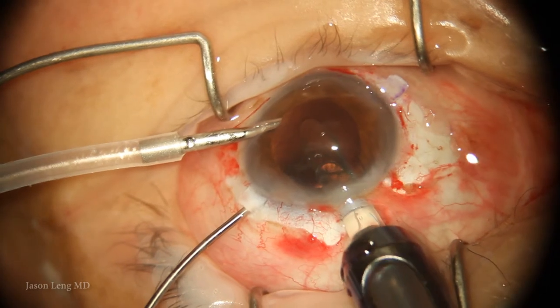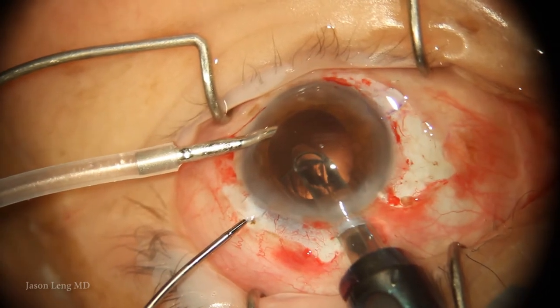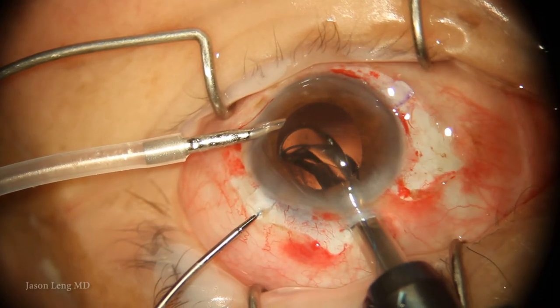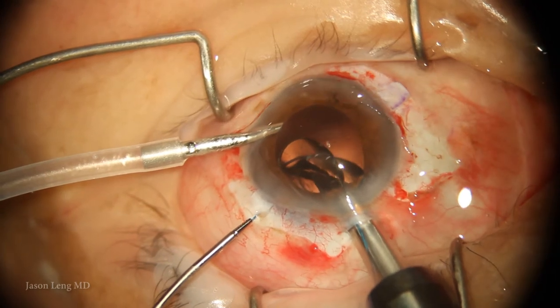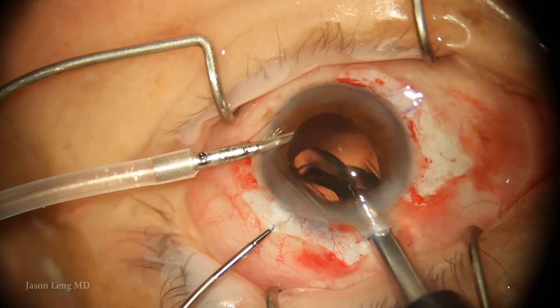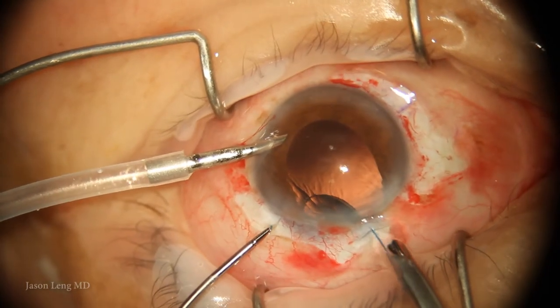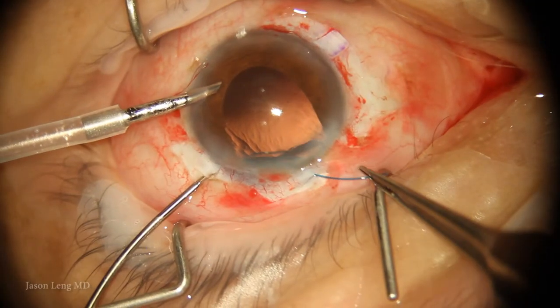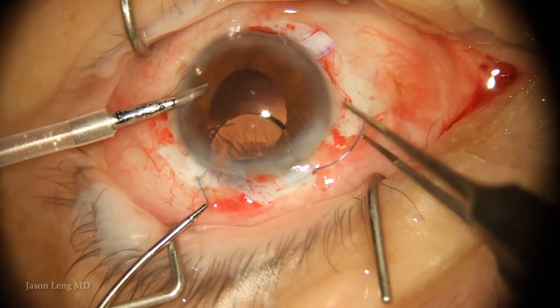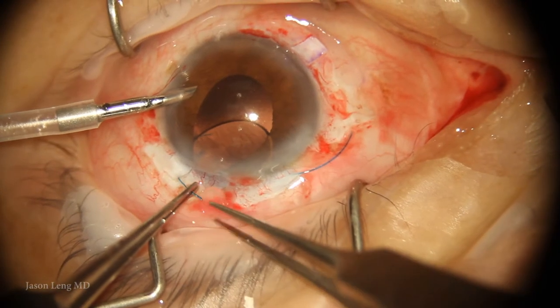I'm using MST micro-holder forceps in my left hand — you want to grab the very tip of the haptic and hold it very coaxially so it doesn't snag, bend, or break when pulling it through the sclerotomy. I'm using a screw-type inserter and having my scrub slowly advance the IOL as I externalize the leading haptic. This is a standard AMO Tecnis ZA9003 lens, which I use in most of my routine cataract cases.